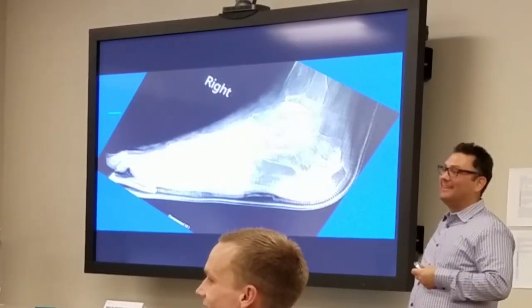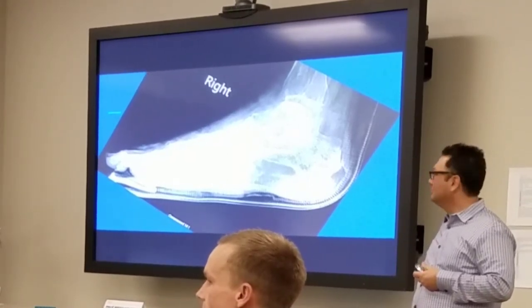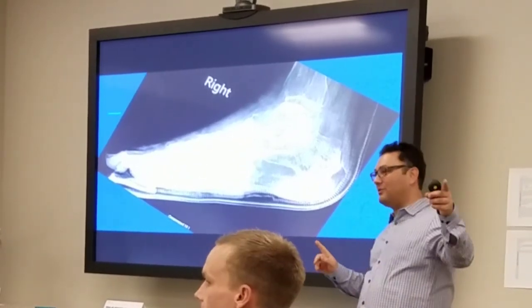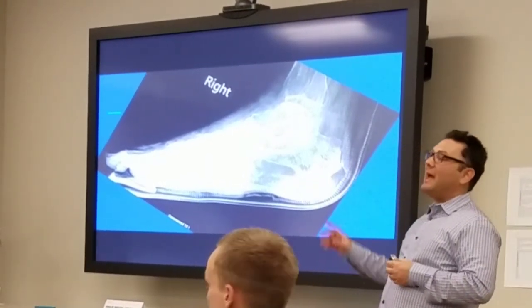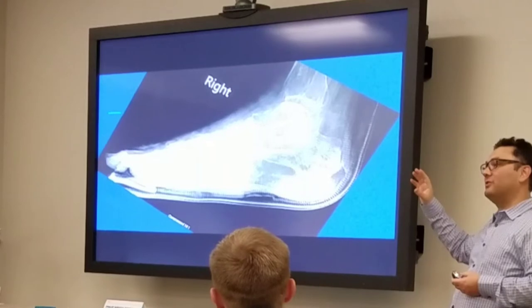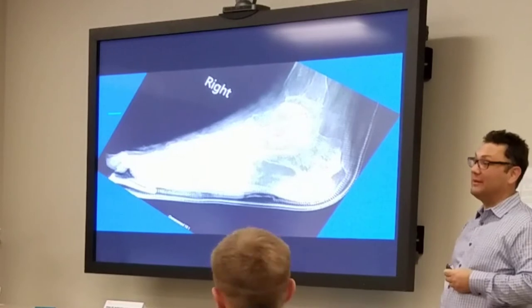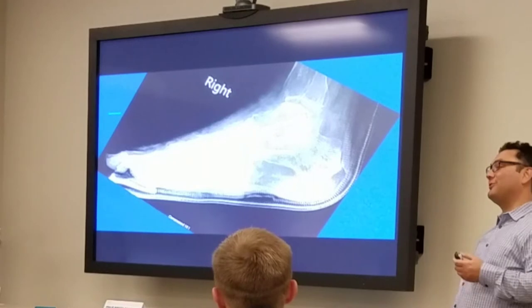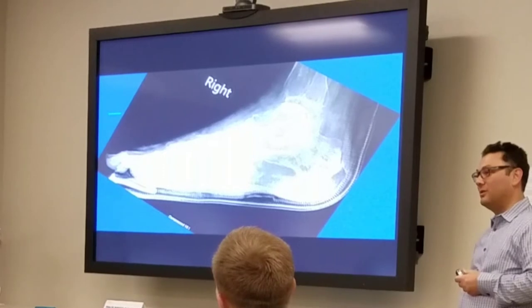Since we've determined that the rear foot is all soft tissue, do you fuse the subtalar joint once you get it corrected? I don't fuse it. Dr. Lott doesn't need to fuse it. And you see, I didn't fuse it here. I wonder what that would hold if it's soft tissue. That's a bony question. What happened in this particular case is the patient started going back into varus. If I would have done a subtalar fusion into valgus, it wouldn't have gone back in. Would it have taken the ankle with it, though? I don't know. You never know with any of this stuff. That's really where the surgeon has to just commit to what he wants to do and live with the decision.